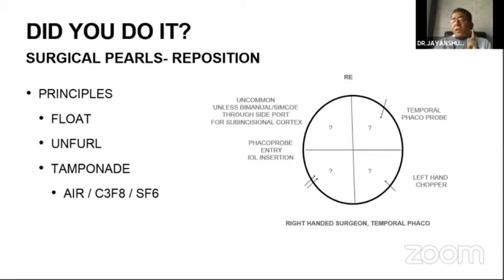If we go to the superior nasal quadrant, we will mostly have detachment, disinsertions, falls from the phaco probe. If we have superior ones, we will have an incision related detachment. This is a mirror image for the other eye, and this is a mirror image again if we are sitting superiorly for the surgery. So according to the surgeon's position, these things change, and it is very important to have a clear idea.